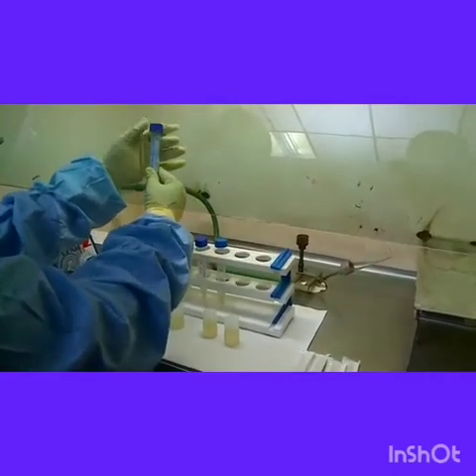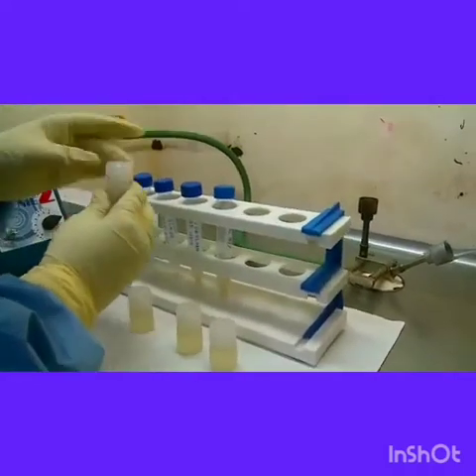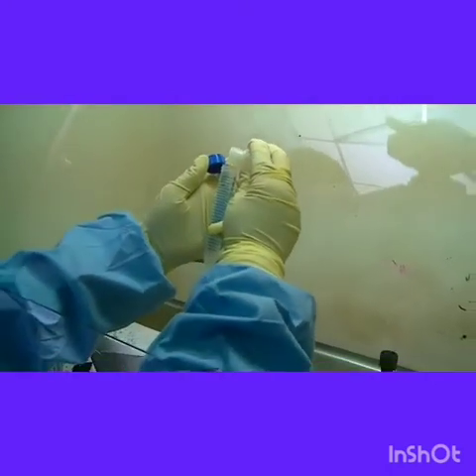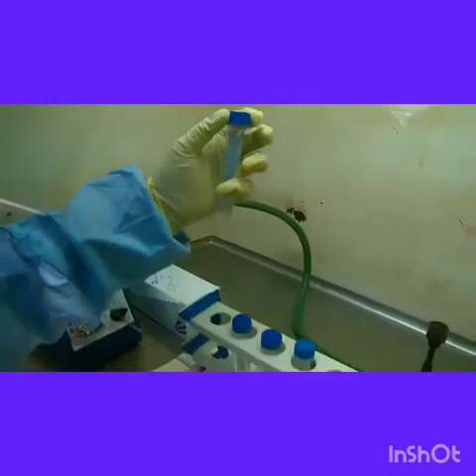We are seeing the procedure as to how to do it. Here we have 4 samples. The first step is to add the sample reagent at double volume to each specimen. Care must be taken to use only one sample reagent bottle for one specimen to avoid cross contamination.